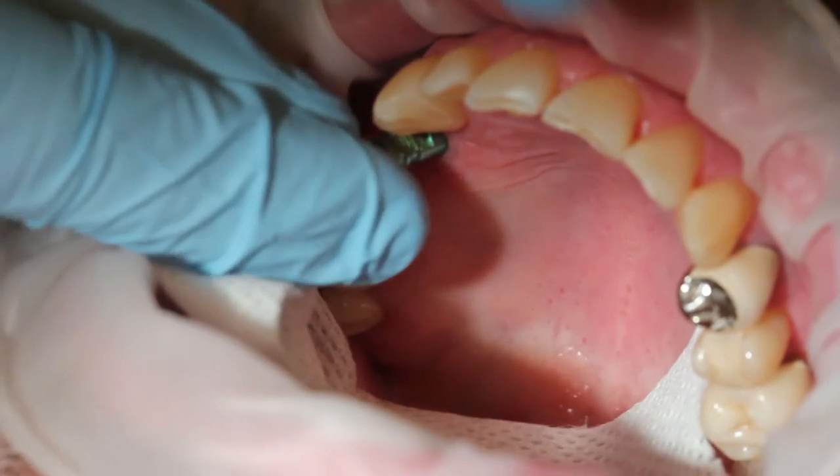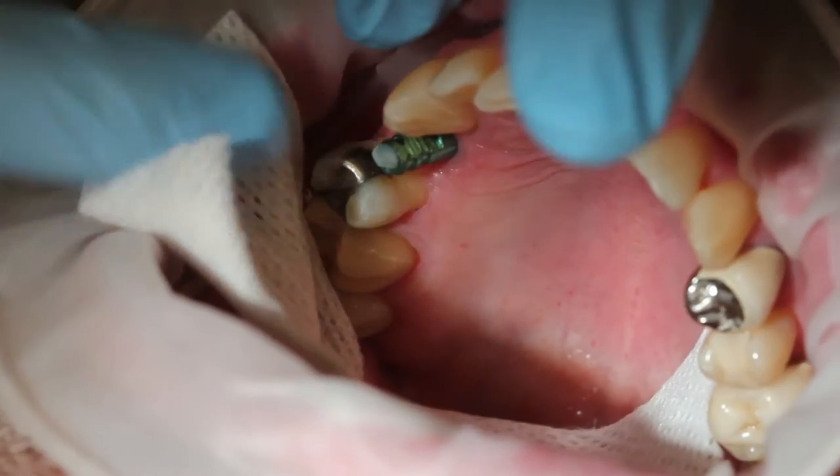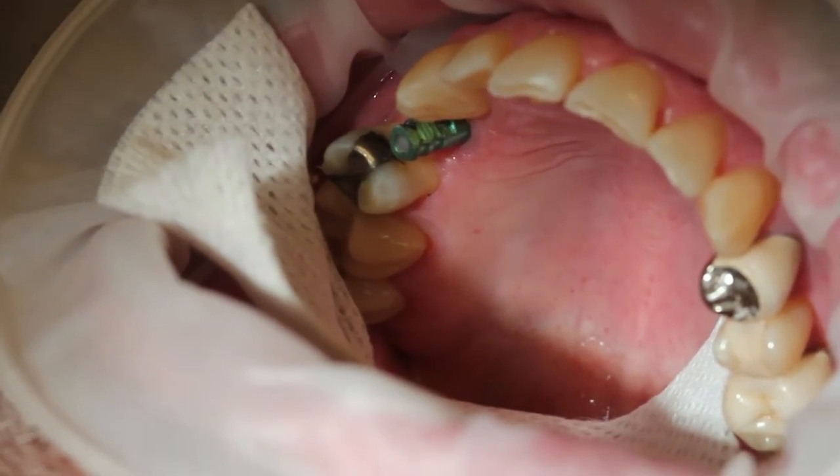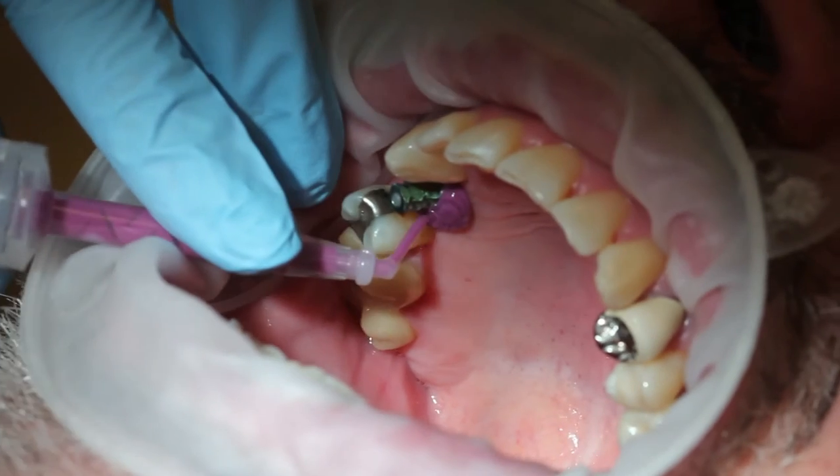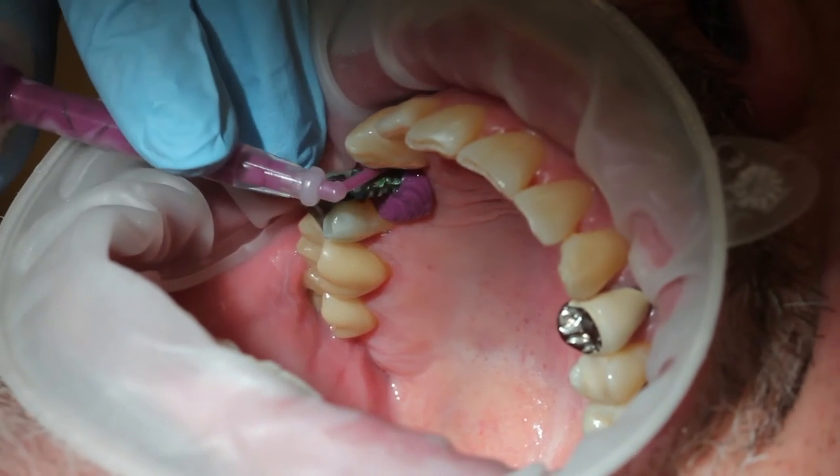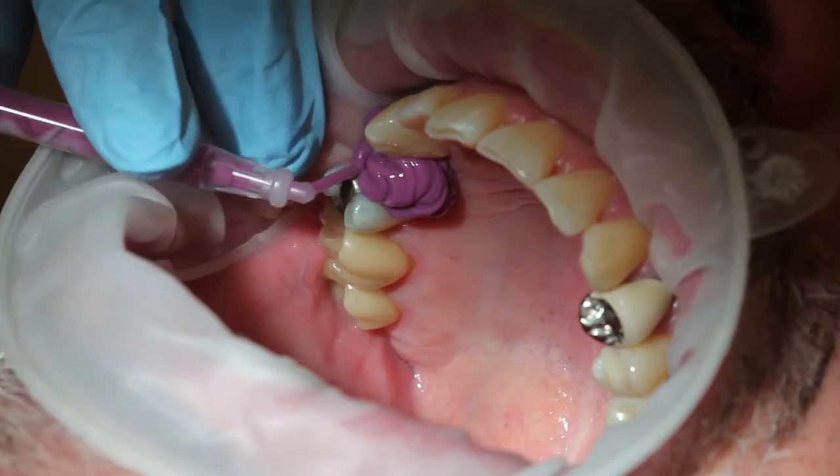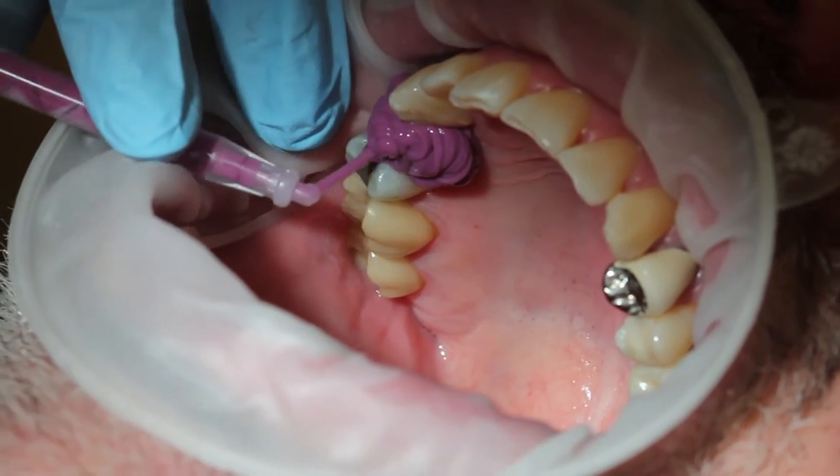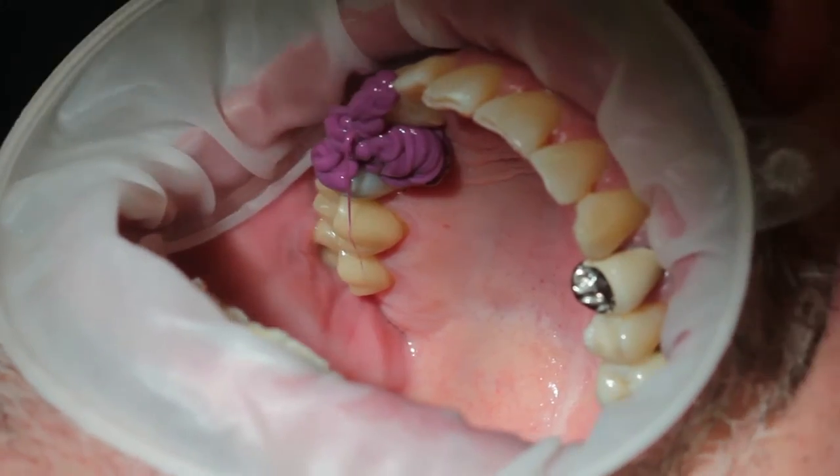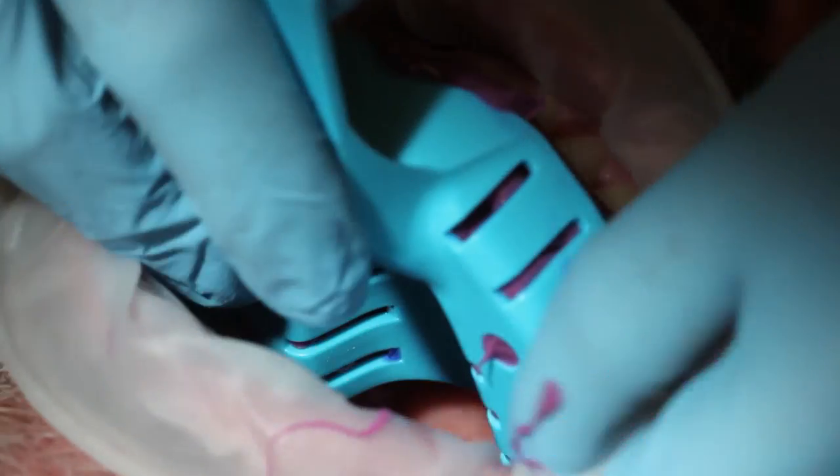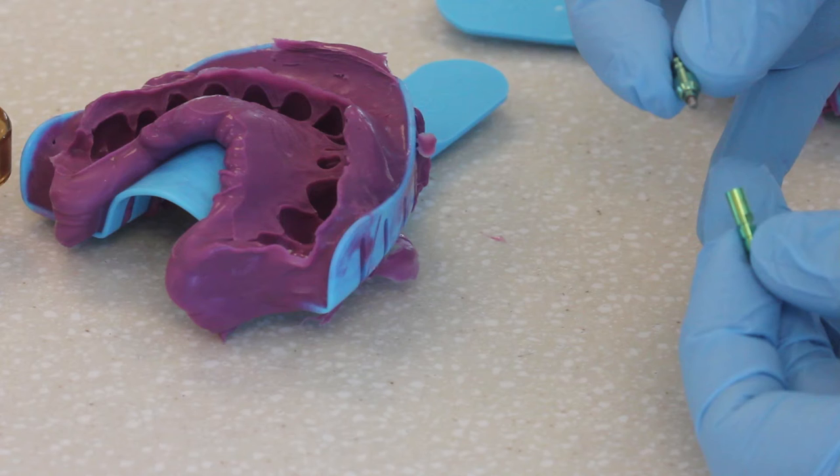The next step is to confirm the seat of the impression coping onto the implant with a radiograph. Once the seat is confirmed, cover the screw hole with orthowax. Use medium body PVS to syringe around the impression coping and some of the adjacent teeth. Also use medium body PVS into the tray. Seat that tray like you would any other crown and bridge impression. After the material is set, remove the impression from the mouth.